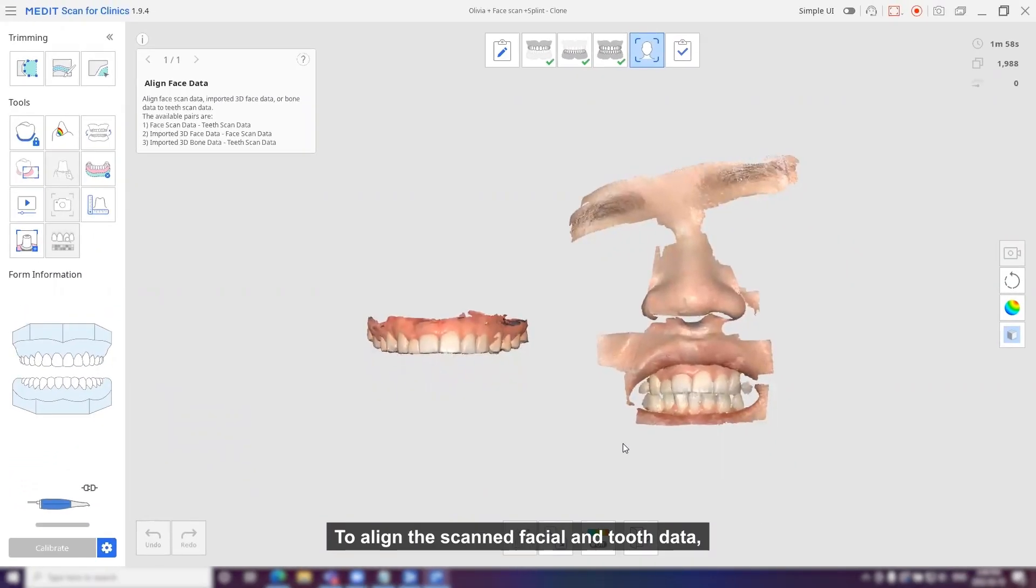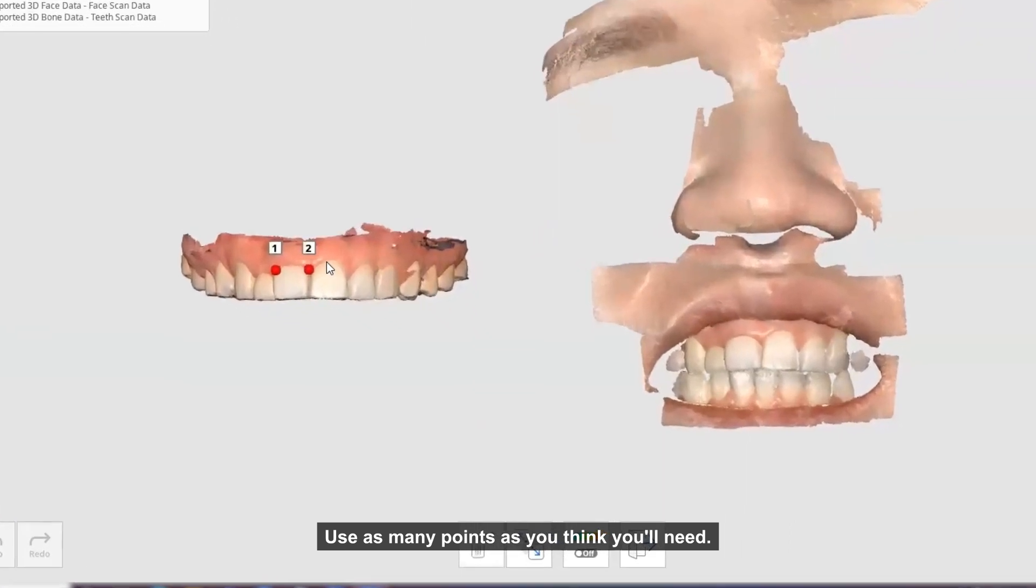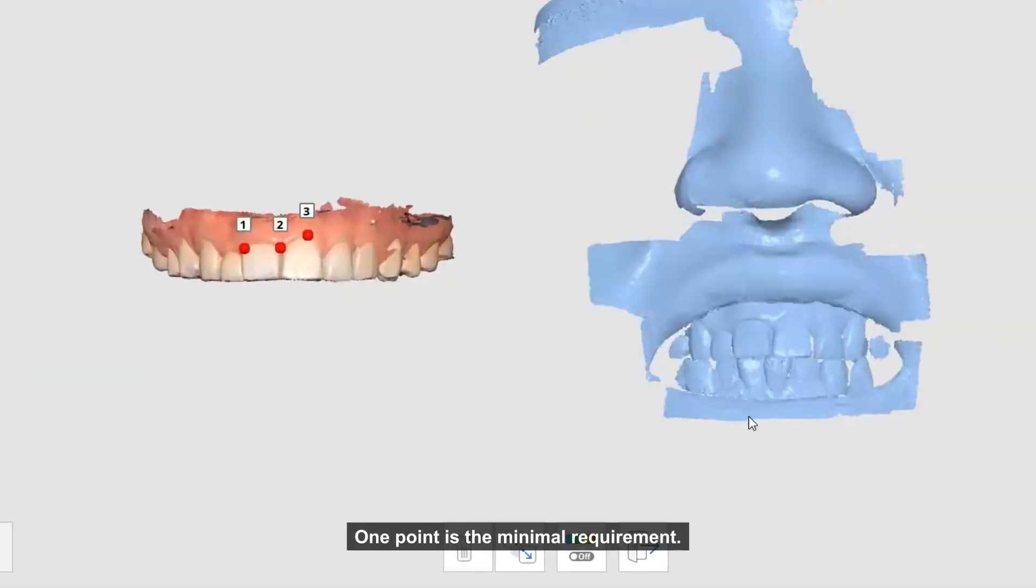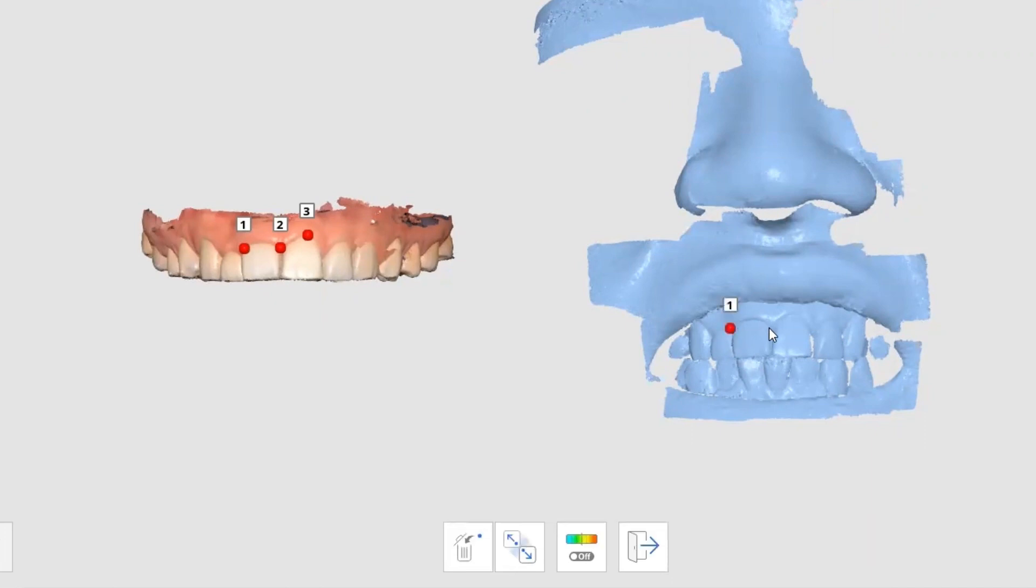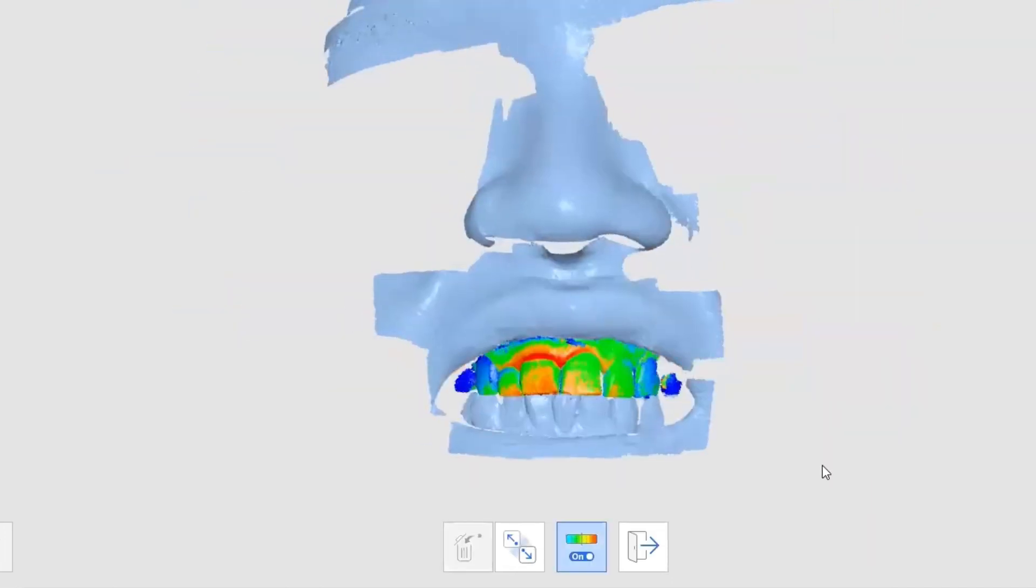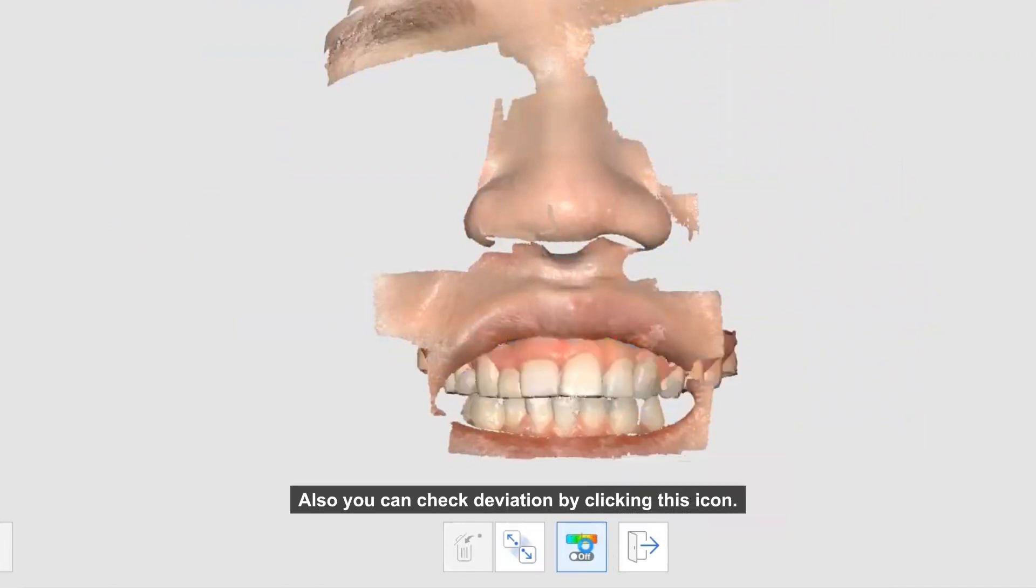To align the scanned facial and tooth data, select corresponding locations on both. Use as many points as you'll need. One point is the minimal requirement. Also, you can check the deviations by clicking this icon.